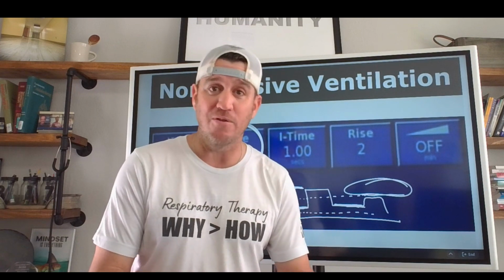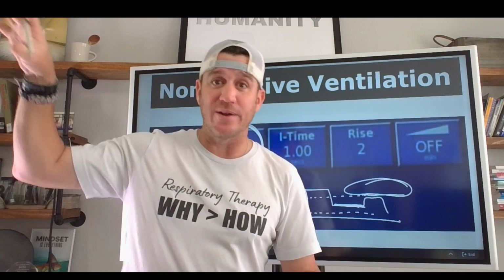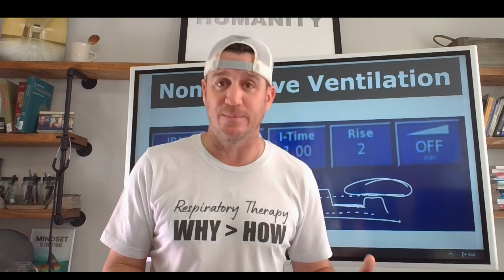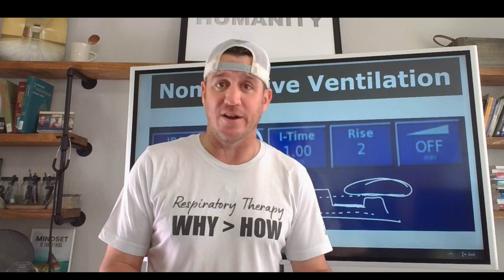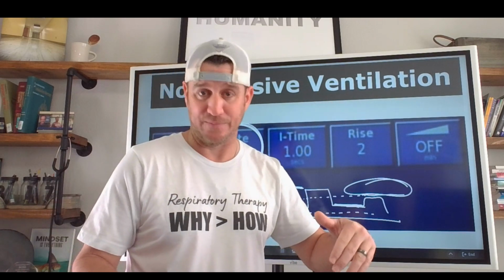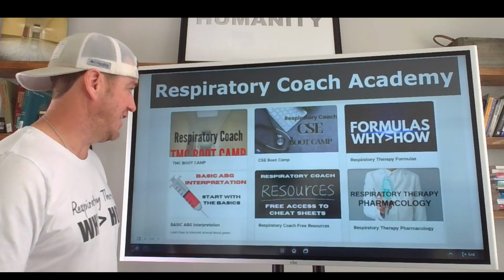And that will let you know at the very least that, hey, something's going on here, because their spontaneous effort has dropped and we're pretty much just cruising on the backup rate, and we don't want that. I don't see good outcomes with trying to ventilate somebody with a high backup rate. It just doesn't ever seem to work out very well. And so keep that in mind. You want that alarm to say, hey, your patient's spontaneous efforts are doing this. Okay. And remember, you've got to think about that in conjunction with your set rate.